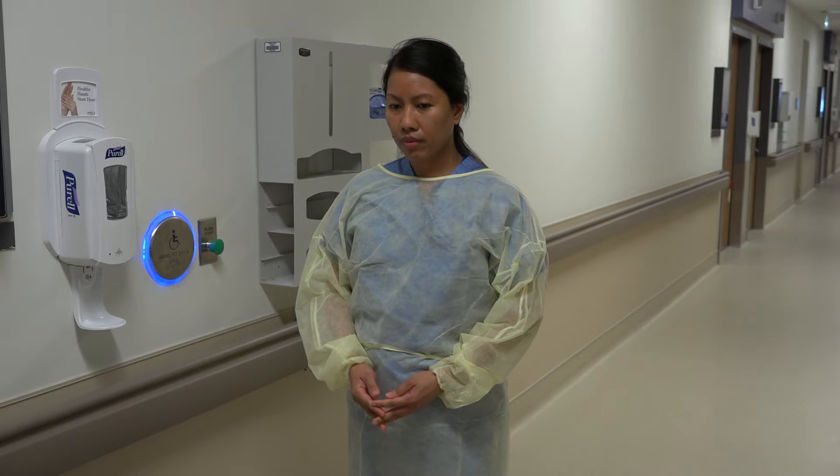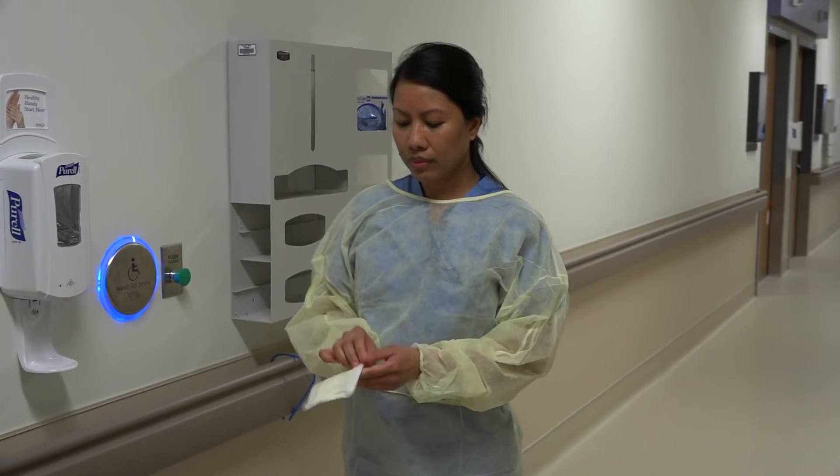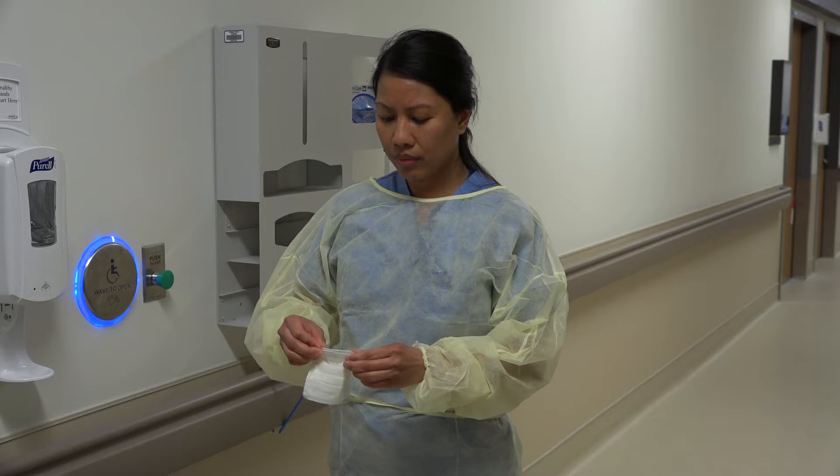The third step is to place on your mask. For droplet precautions, the mask to be worn is a procedure mask. Note that this is different from an N95 mask.